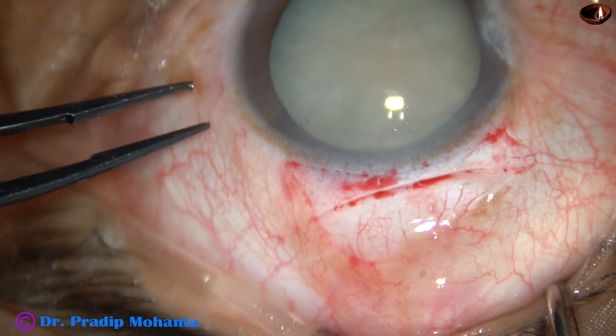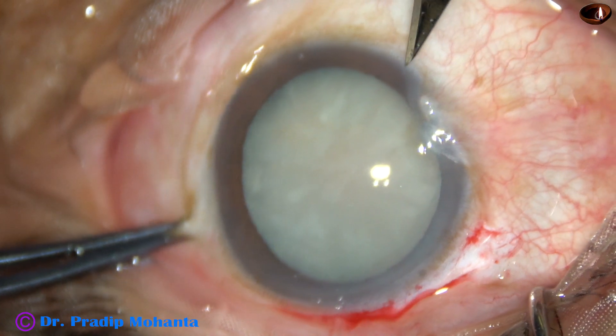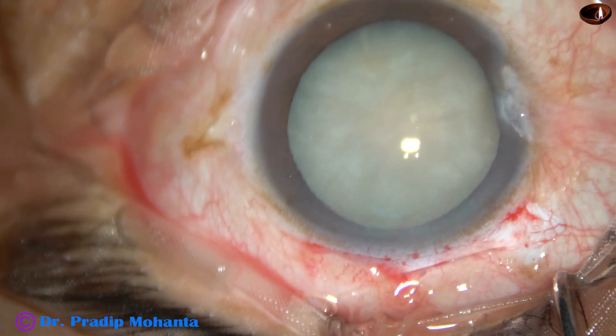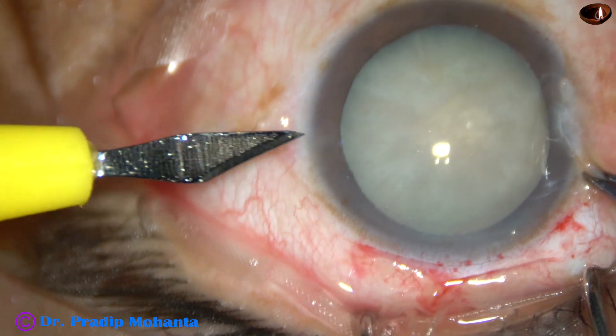If the corneal valve is good like this, you will never need a suture. In this case, I am going to do two side ports. This will help me in hydro implantation of the intraocular lens.